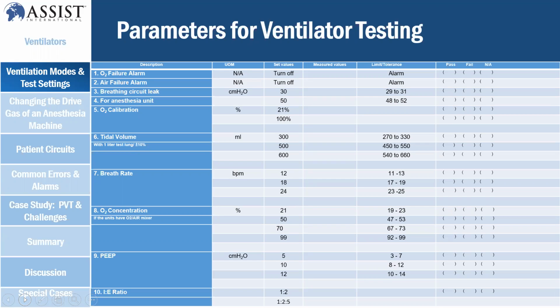Very important: self-test verification. Verify the sensor, the leak test, all that, and check that it passed during the verification. Once it passed, you have to go to setting the tidal volume, respiratory rate, and positive end-expiratory pressure, PEEP. It depends what setting you're using, but if you ask me, I'll run on the volume rate and set certain things and see the output. So you have to check all this, then the IE ratio, the alarm as well.